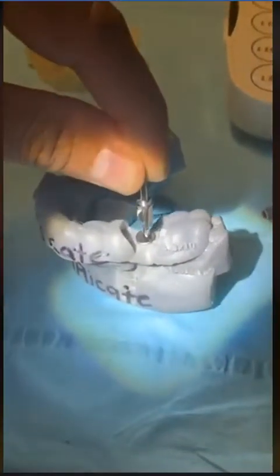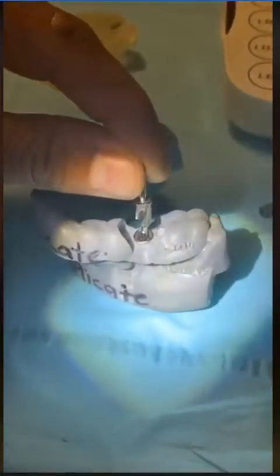No questions? Let's move forward. Okay. Now, the first thing you do on a guide is to make sure that we take the benefit of the guide fully, 100% all the time. This implant is going to be a 4.3 by 13, right? So let me take a pilot burr of a 4.3 by 13, okay, and I put it in here.